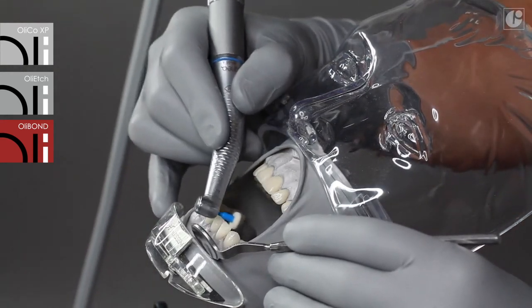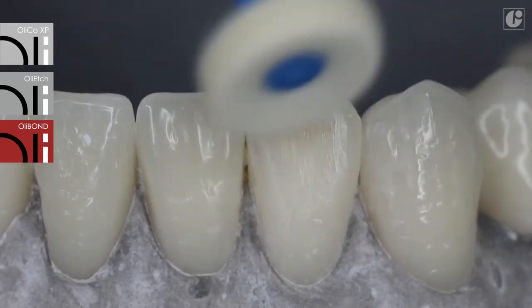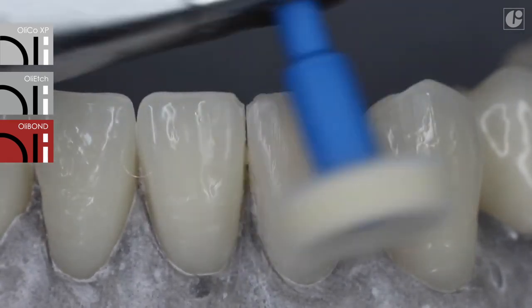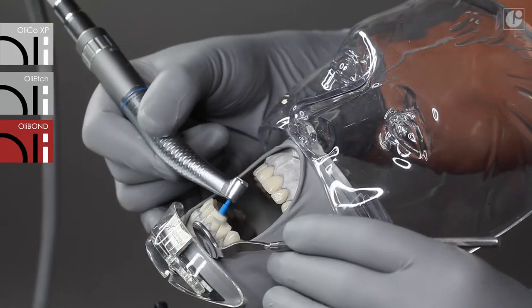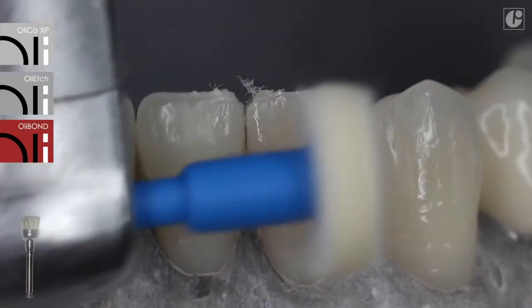Polishability is an additional advantage of the OliCo XP composite material. It is enough to use felt to smooth the surface, and the final shine is achieved using a hard diamond coat brush.